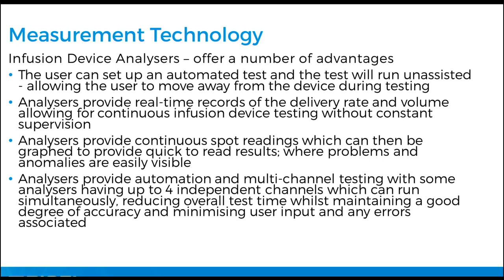So the analyzer itself also has a real unique selling point, so to speak, which is that you get readings straight off the bat. You can have a look at the screen, and each parameter will give you a moment in time reading. So you don't have to extrapolate readings by calculating volume and calculating flow rates. You get instant flow rates, you get average flow rates, you get volume that's been infused, a look at pressure and all. So if you have an incorrect setup, all these anomalies are instantly available.